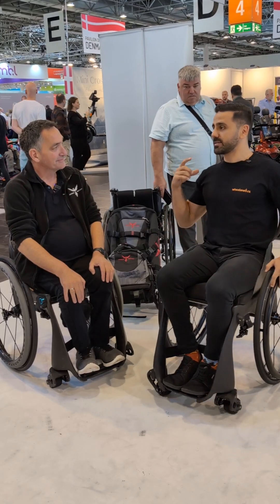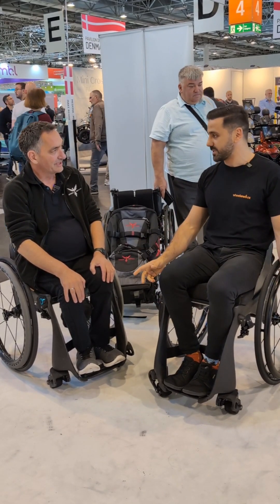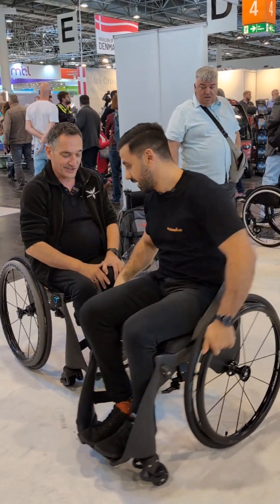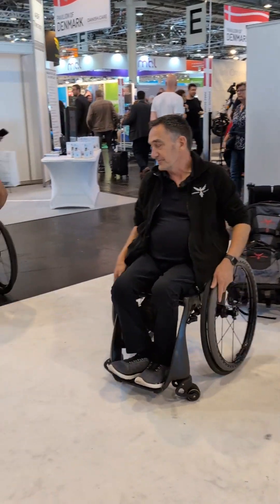And there's no separate controller. You just set your speed and then pull on your hands — you just push and it starts. Everything you do, if you want to go faster, you turn up to go faster.